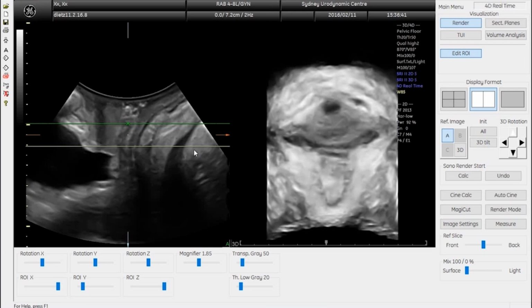Next, I'll demonstrate tomographic imaging of the puborectalis in a patient with a substantial three-compartment prolapse. We start with a standard two fields of acquisition here on the left-hand side, the mid-sagittal plane with the symphysis pubis, the urethra, the bladder, the cervix here, the vagina here, the anorectum here, the anal canal here, and the anorectal angle here in the back with the levator plate here.